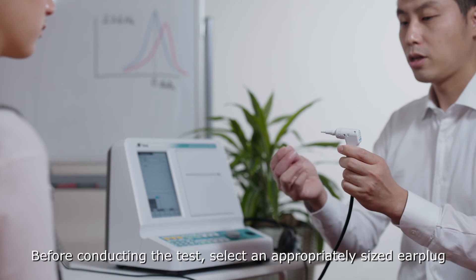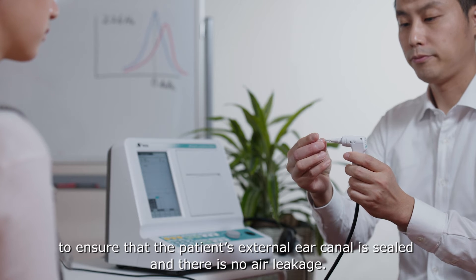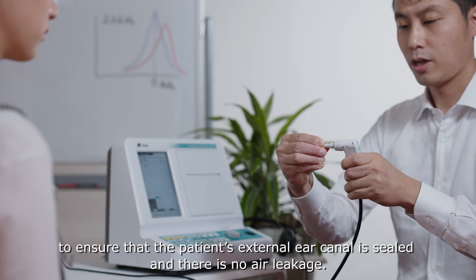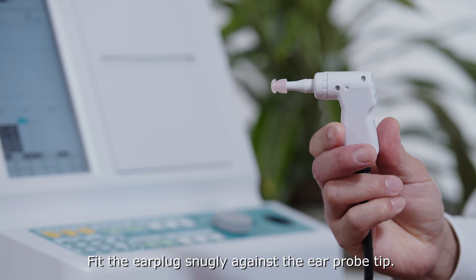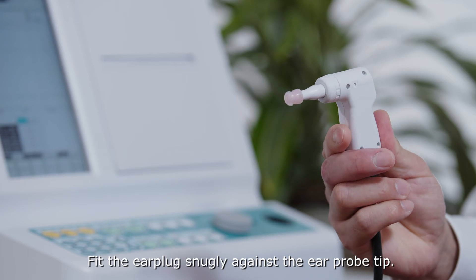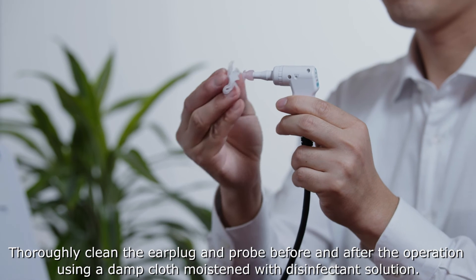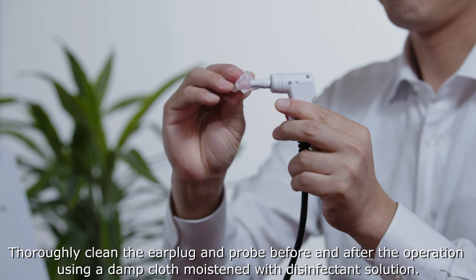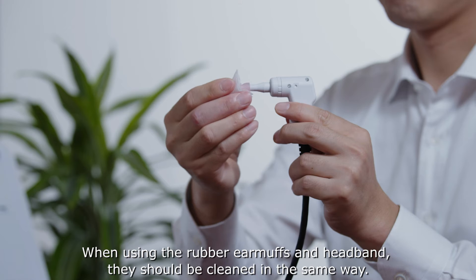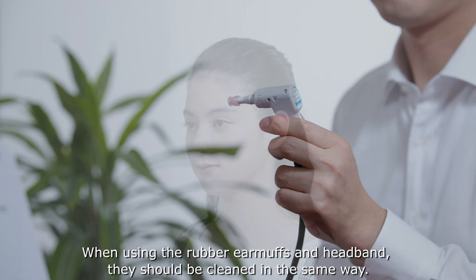Before conducting the test, select an appropriately sized ear plug to ensure that the patient's external ear canal is sealed and there is no air leakage. Fit the ear plug snugly against the ear probe tip. Thoroughly clean the ear plug and probe before and after the operation, using a damp cloth moistened with a disinfectant solution. When using the rubber earmuffs and headband, they should be cleaned in the same way.